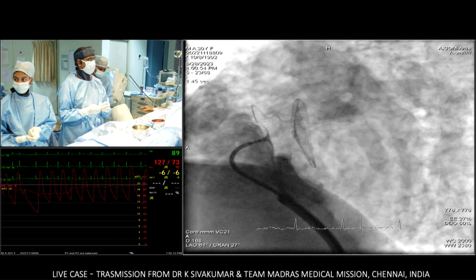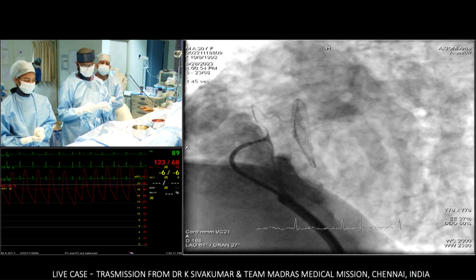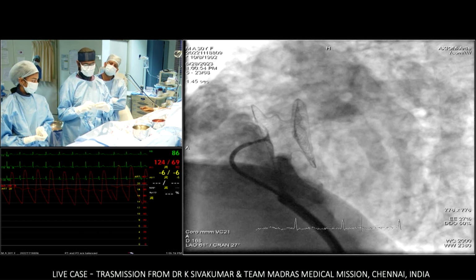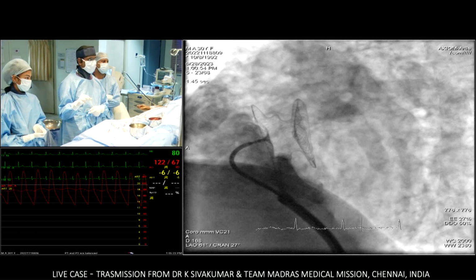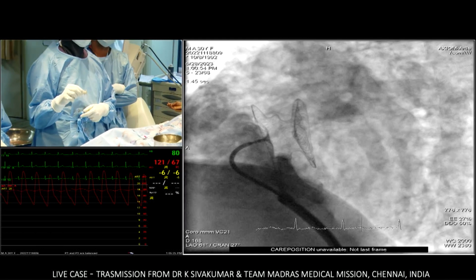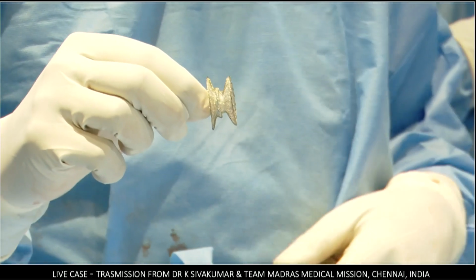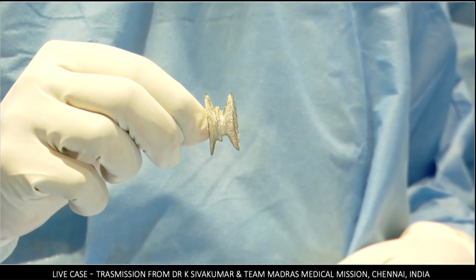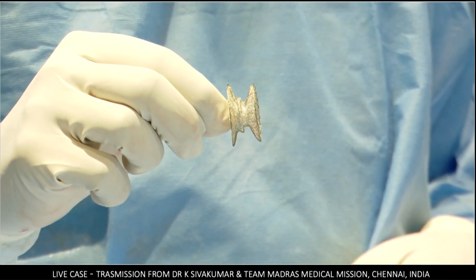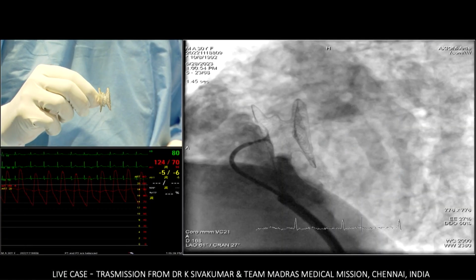Shaq, can I ask a couple of questions to Shiva? Hi, Bharat. Go ahead, Bharat. Shiva, great demonstration. I have two questions for you. One is the separation between the left and the right atrial disc, as Shaq pointed out. Does it concern you from the point of view of thrombus formation in the space between the disc and the septum before it endothelializes? That is question number one.